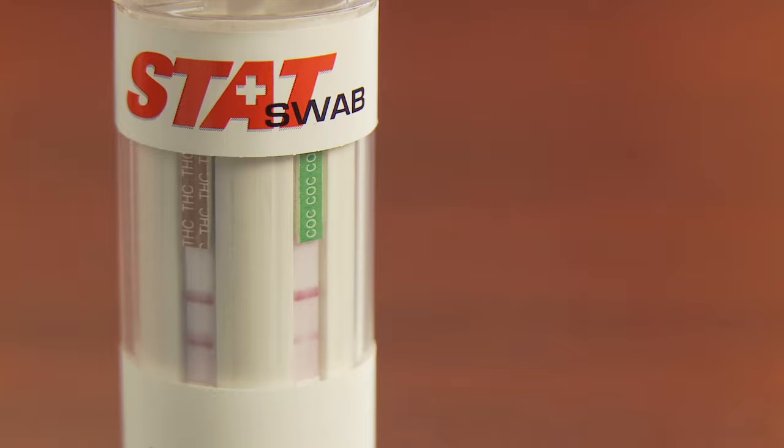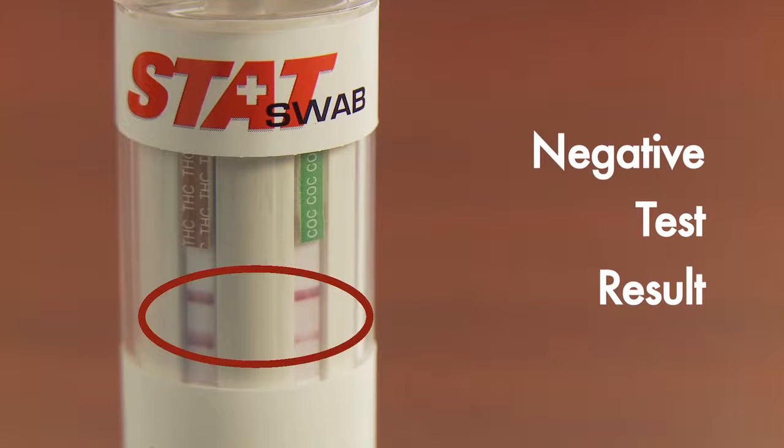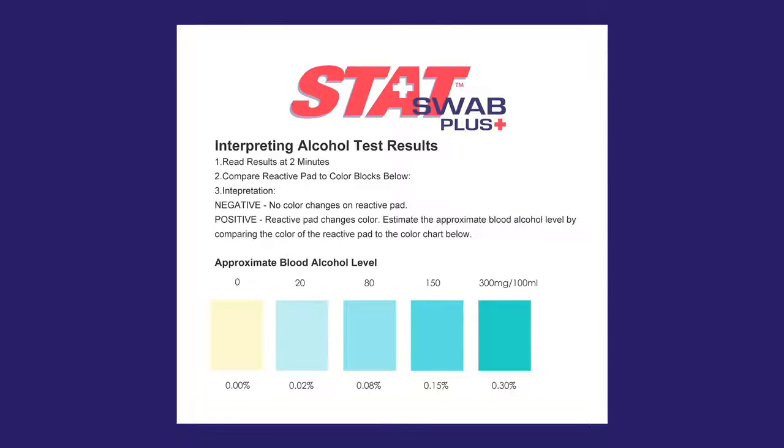If the donor tests negative for the substance, a second red line should appear in the test region. Any line that appears, regardless of color intensity, should be interpreted as a negative result. After 10 minutes, if a second line has not appeared in the bottom test region, this should be interpreted as a preliminary positive result. Any positive StatSwab result should be considered preliminary and should be confirmed by an alternative method.